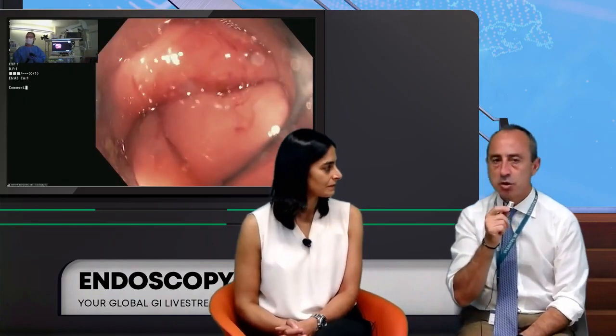So Marita, I have a question. I was fascinated by this EndoRotor procedure with a lot of debris in the pseudocyst speeding up. What is your experience with this EndoRotor device?